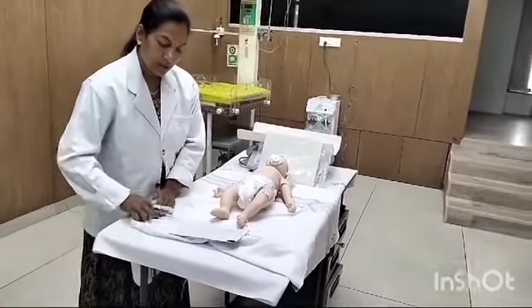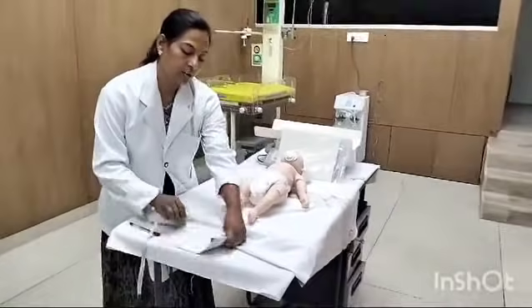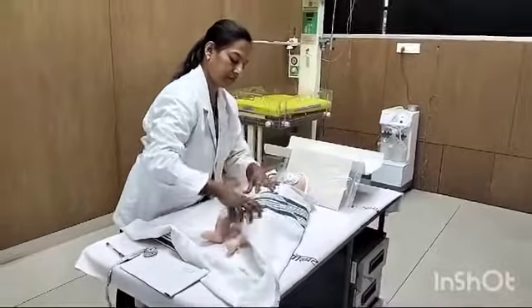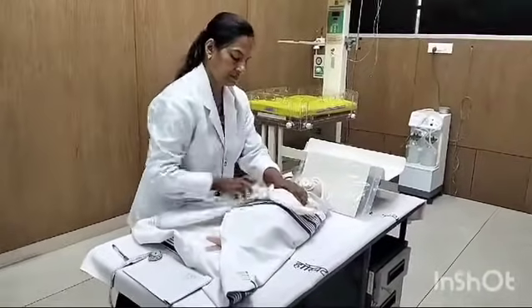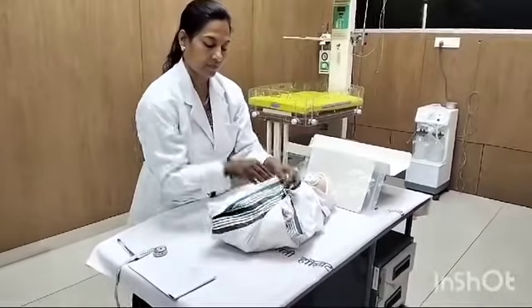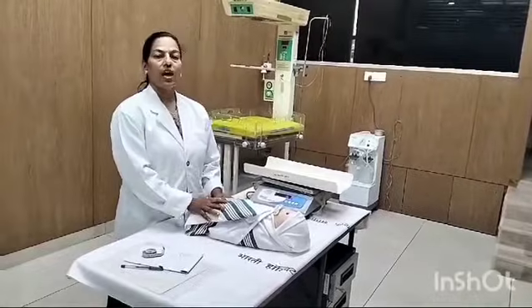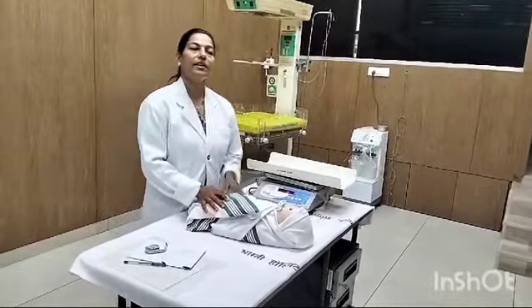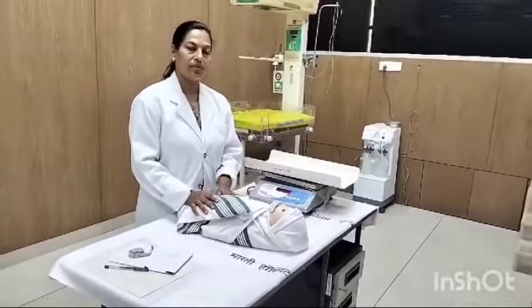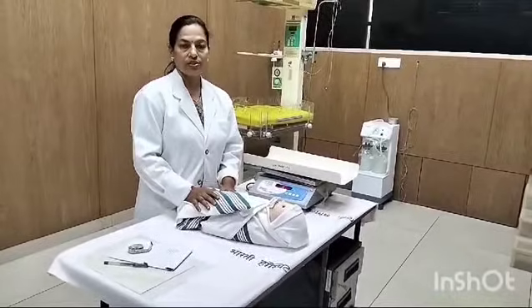As soon as possible, after finishing and taking all anthropometric measurements, you need to cover the baby. Today we have learned about how to take anthropometric measurements — including head circumference, chest circumference, mid-arm circumference, mid-thigh circumference, abdominal circumference, and the height and weight of the child.